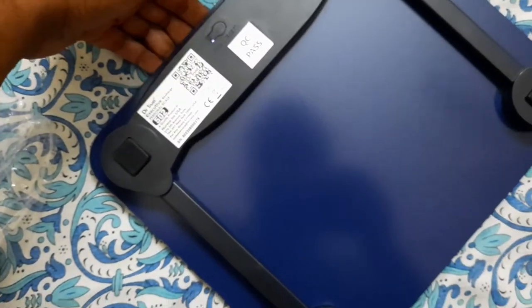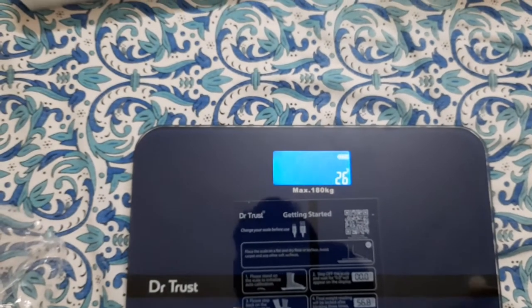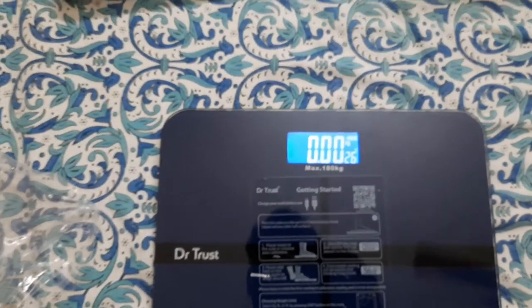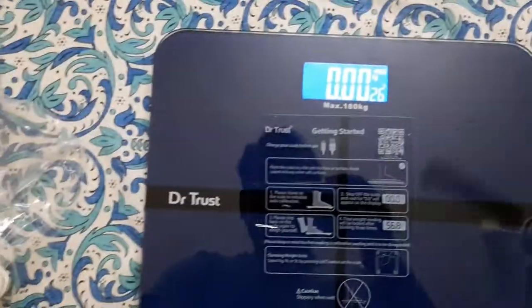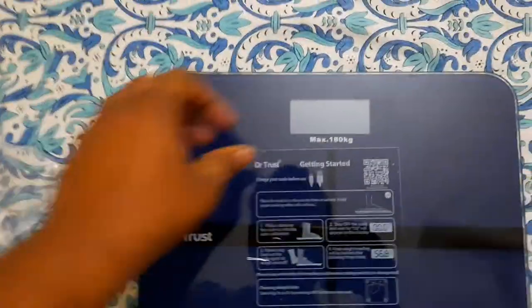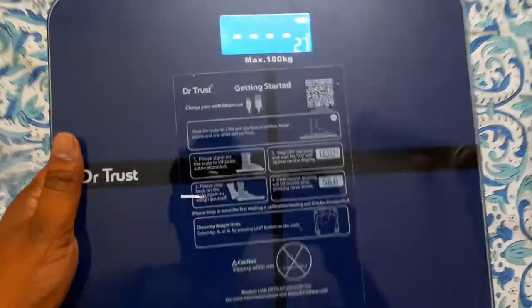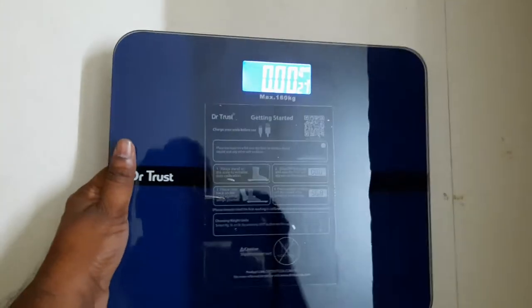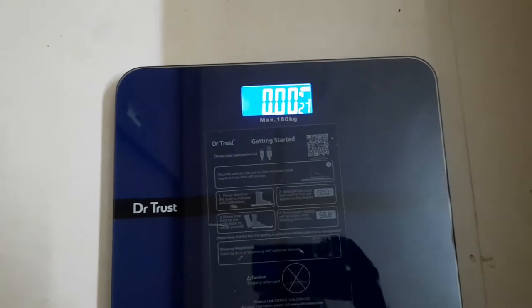I powered it on and it is showing 0.80 kg, and now it has reset to 0.00. It is also showing 26 degrees Celsius, which looks accurate because I have the AC on in my house and it is showing a similar temperature.